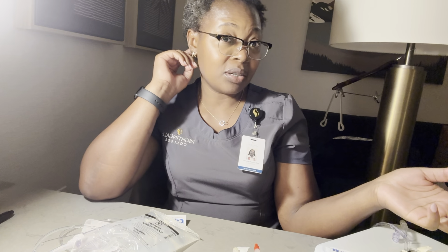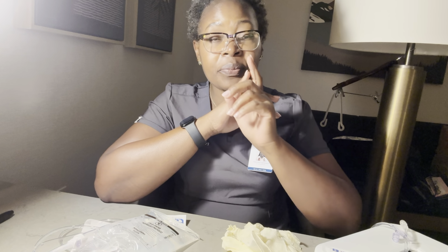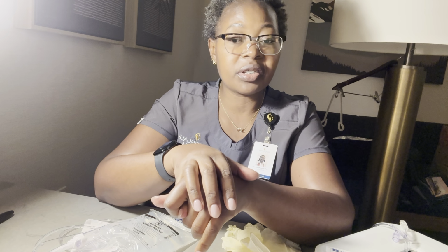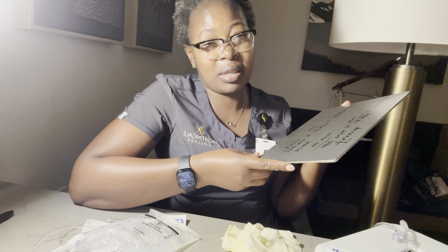Can you verbalize your name and date of birth? And I'll use your wristband. His name tallies with my record. I'll provide privacy and perform hand hygiene. I'll also confirm the doctor's orders that I have, and the doctor's orders tally with the fluid and medication that I have.